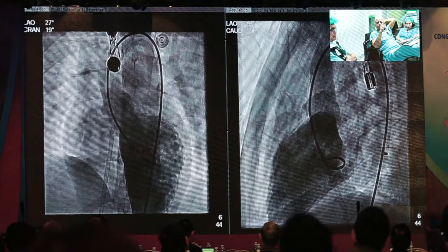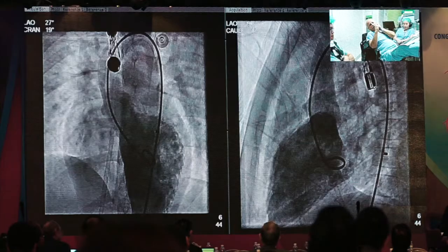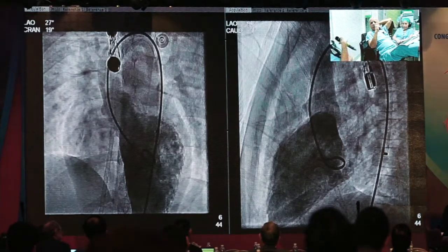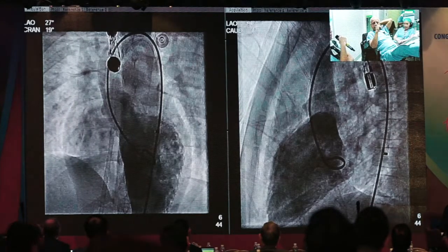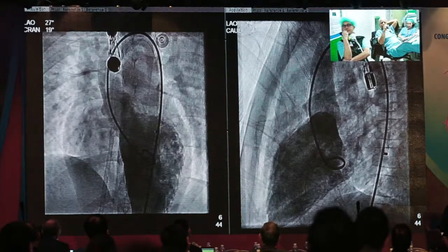Normally I believe in the angiogram rather than echo. But because the defect is quite big, and the echo looks pretty big, so it comes together, so we just need to reassess with the angiogram. Right. So when we put the sheath across the defect and do another angiogram, we may see the anatomy more clearly.